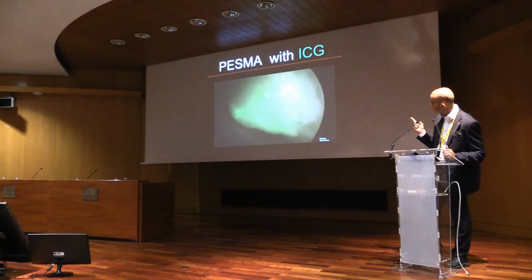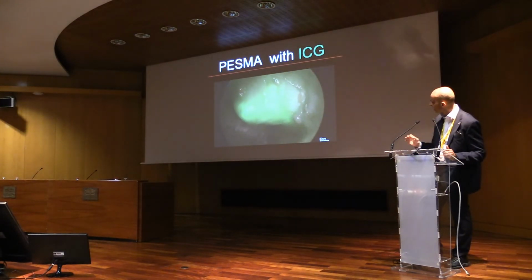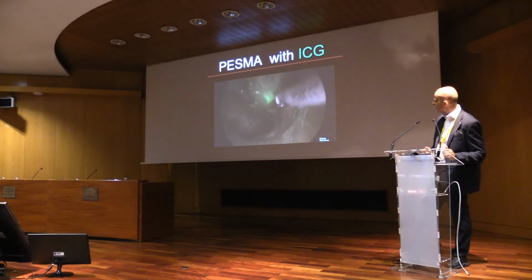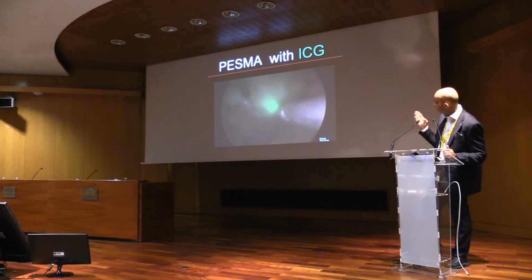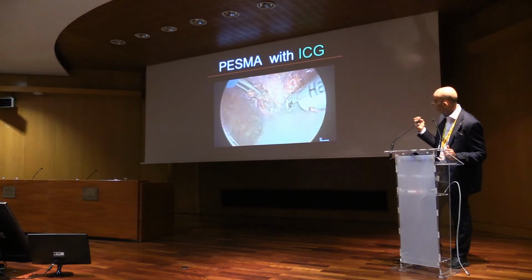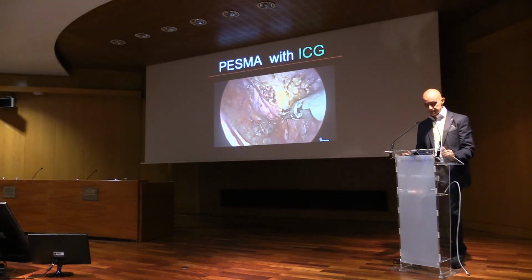Thanks to green you can identify the gland, and you can section the gland, leaving only 1 centimeter of gland behind the nipple. And as you can see, we use a sealing device to do it. You can see the gland because it's in green. If you switch to clear view, you do not have a good view of the gland. This is potentially another indication. Next.